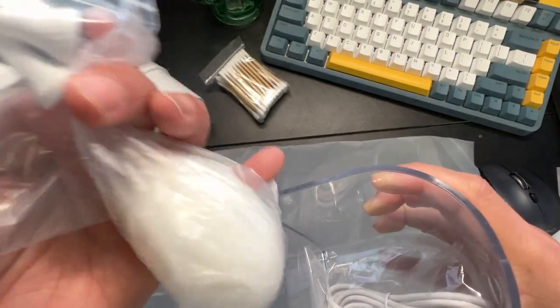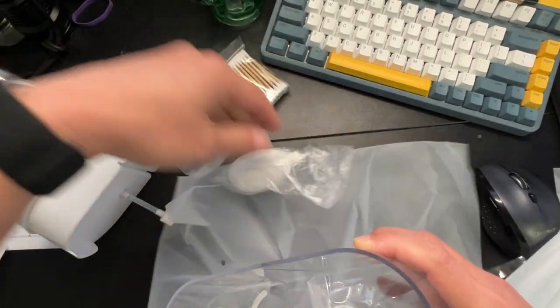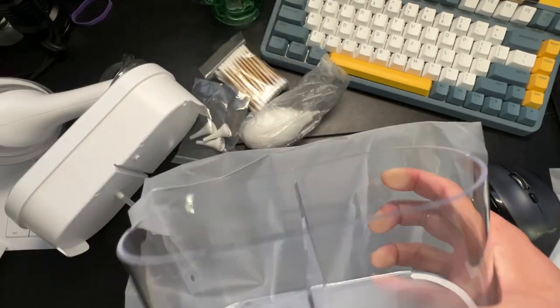I'm going to give it a shot. It gives you a little manual tube so you can squirt a little water on your own. Here are the different tips for different people, and the USB charging cable.